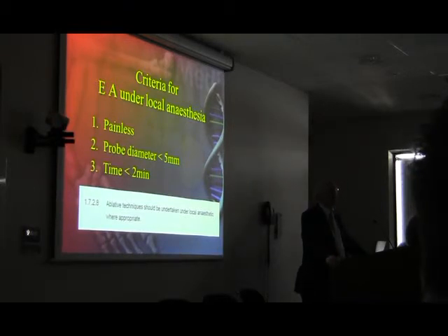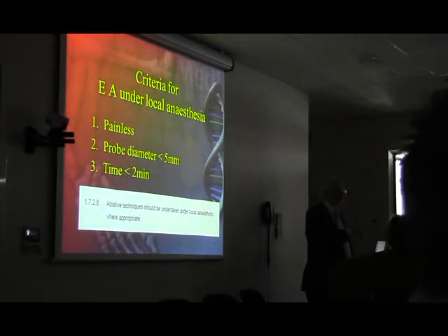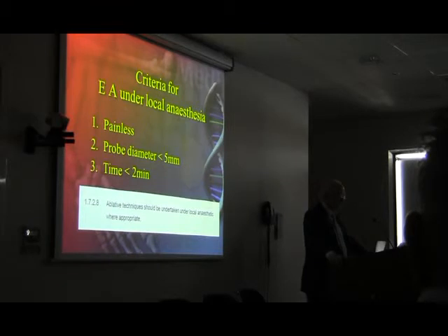I don't know, in the UK, are there many that have been done under local? Not that many, really. In some senses, a lot, but overall it's probably a very small proportion. And this still managed to get into the NICE guideline as being the way to do it. You know, so I don't know.